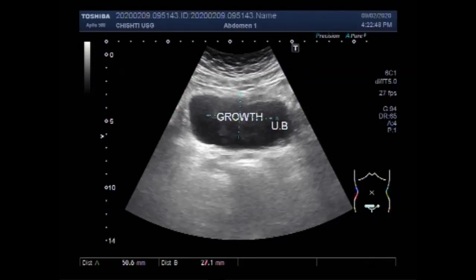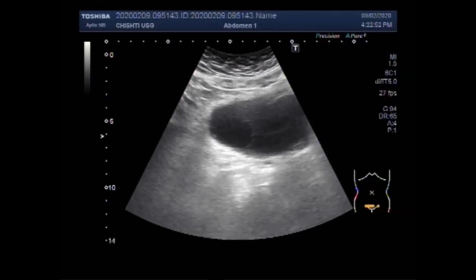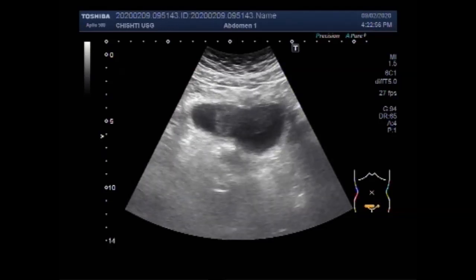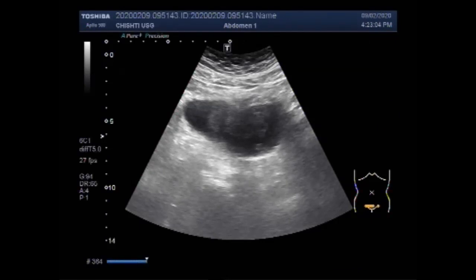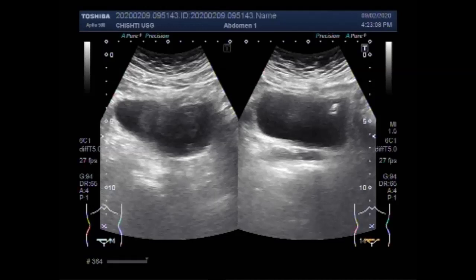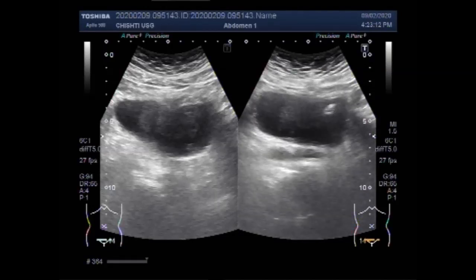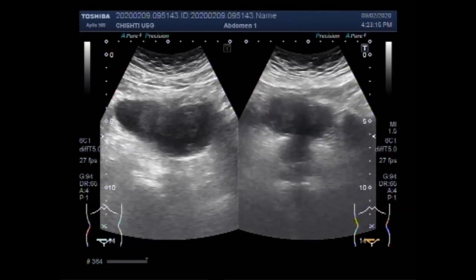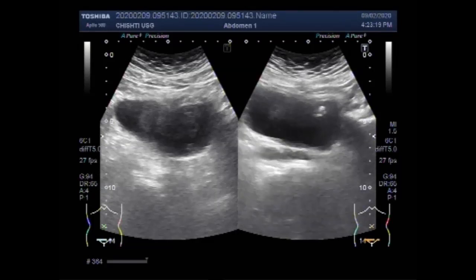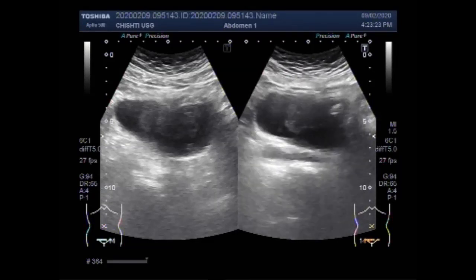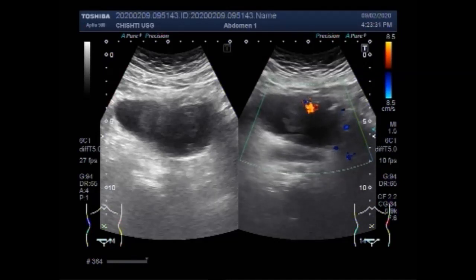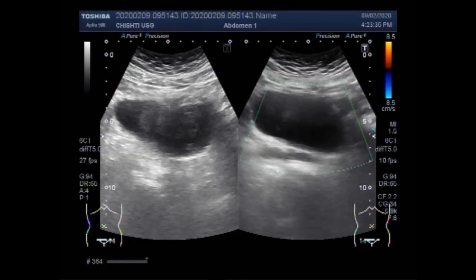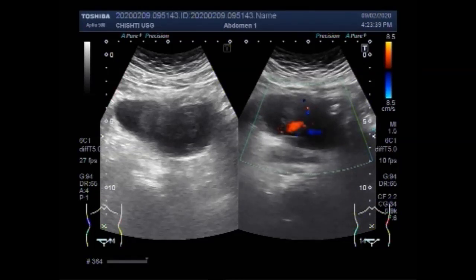You can see the mass is quite a large mass. You can see the measurements on the screen. A significant blood flow is also seen in the mass. The mass is attached to the roof of the urinary bladder and along the right lateral wall of the urinary bladder.